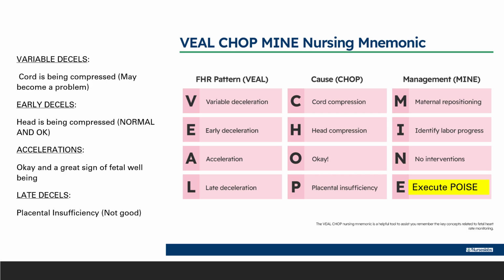A is for acceleration, and that is okay. That's great. This means that the baby's oxygenated. We are not concerned about the fetal well-being. The baby's doing great. The baby's happy. The baby's healthy. We just continue to watch, so there are no interventions required.